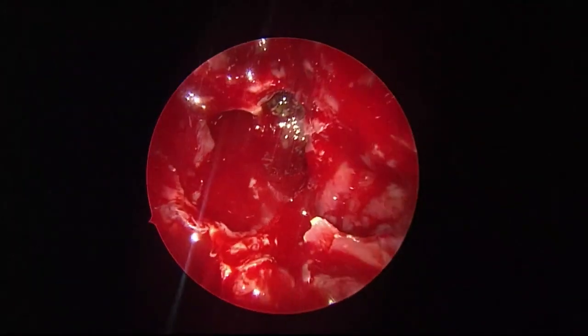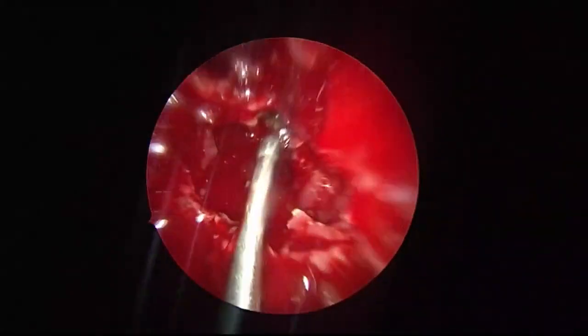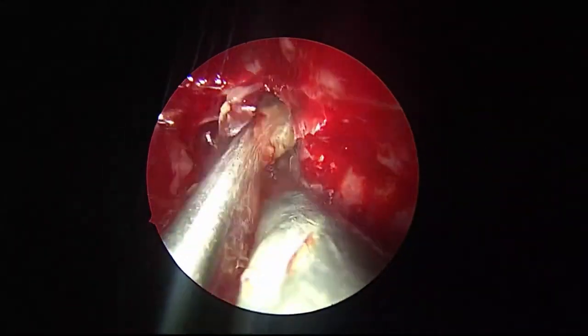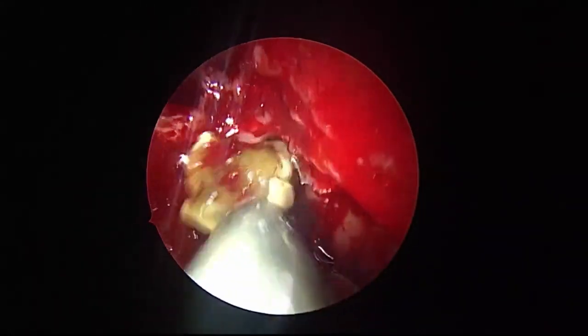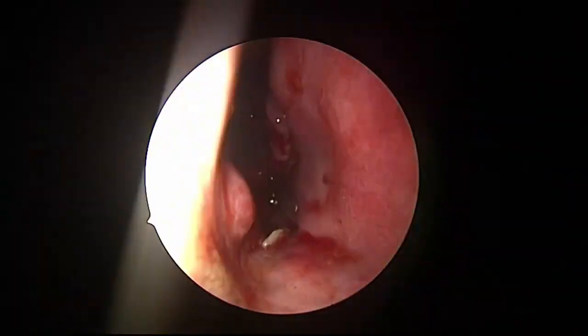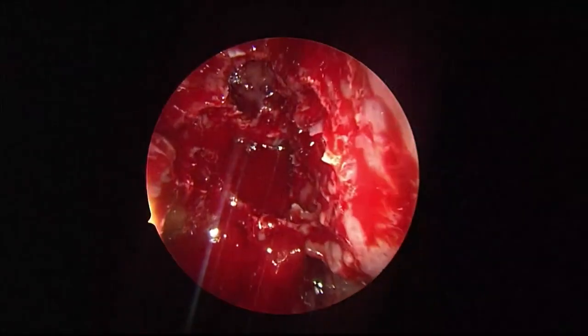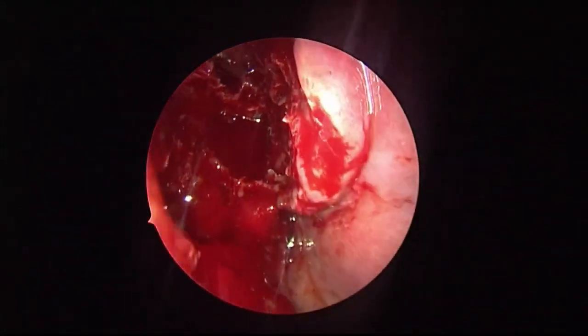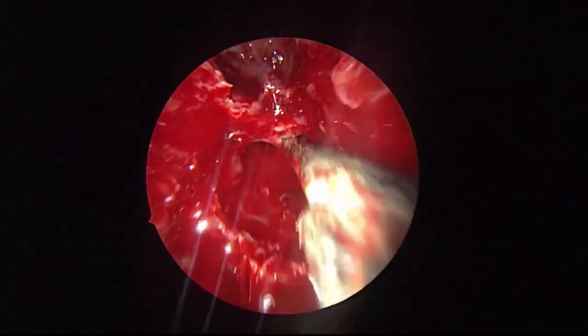Takes away so fast. Now, see here, some fungus is lodged. See this. Out. I took another one. See this, the postethmoidal roof being cleared off. See now, very clear.